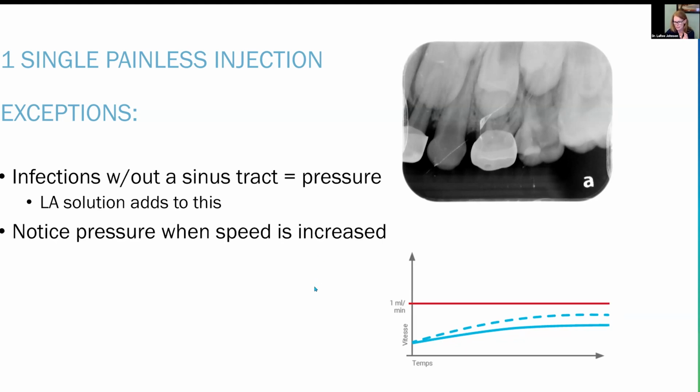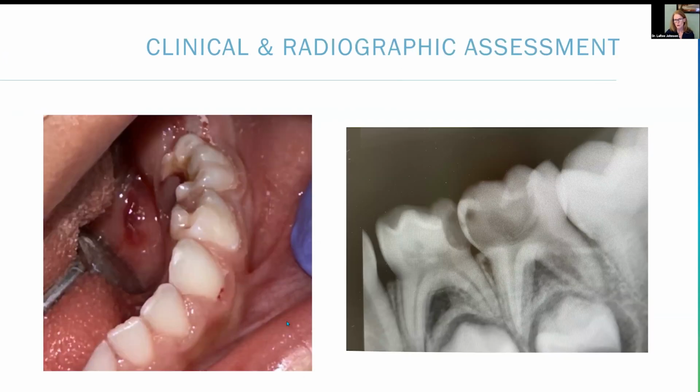Just be cognizant. Usually, if they're making that noise, they're feeling pressure, and you almost immediately, simultaneously, will see the pressure indicator showing that. It's kind of like if you're doing a sedation, you're looking a little bluish on the lips, and then you look at the pulse ox and it's starting to go down. So be a good clinician first, listen to your patient first, read your patient first, and then look for the identifiers on the device. A good clinician will always supersede an electronic device in making sure they're taking good care of their children.